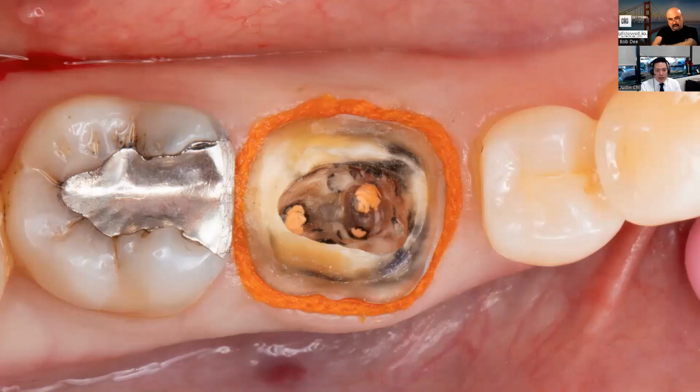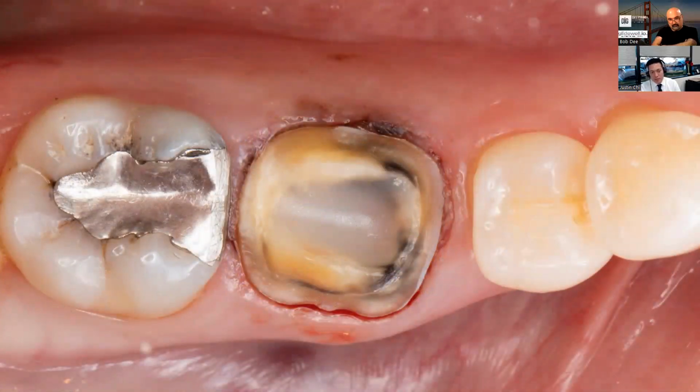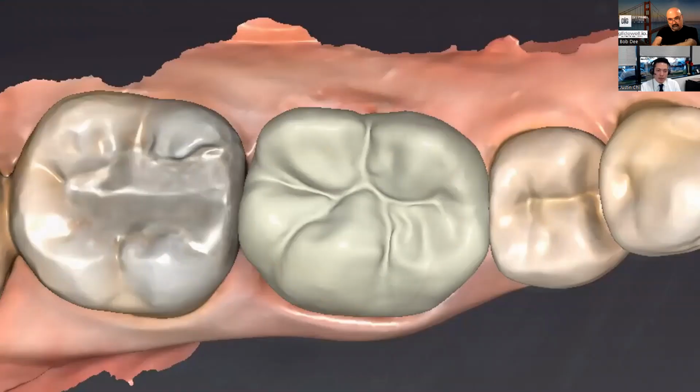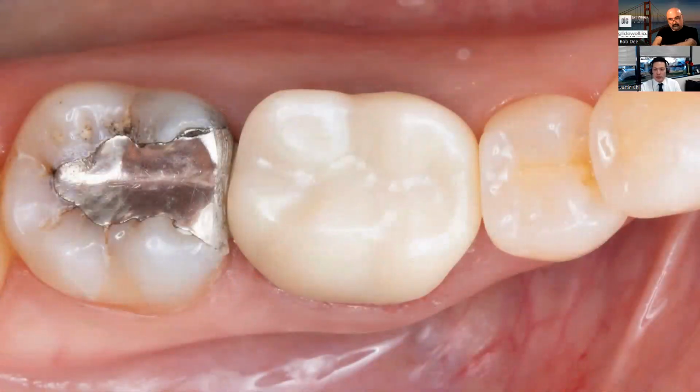So I did a little bit of a hybrid. So I did a slight buildup. I just put some composite buildup material down at the base just to smooth out the access area. And from this, I just went ahead and scanned that in. So part of this crown contained the buildup. So this is what that design looked like from the occlusal, and just to show you how accurately the mill creates that restoration. Once again, a Bruxer now with very minimal polish on here.